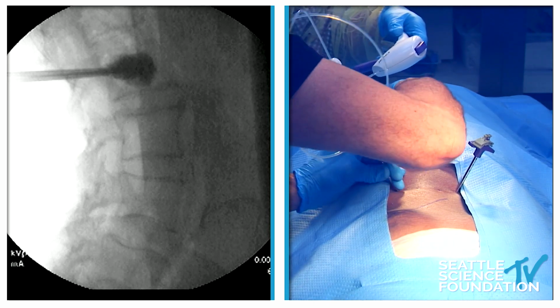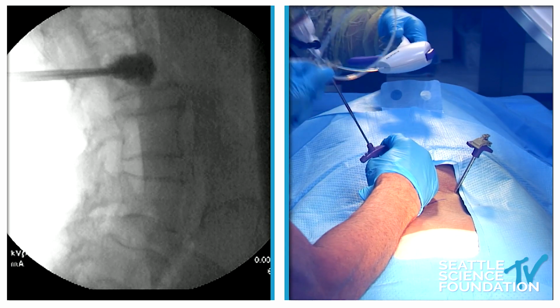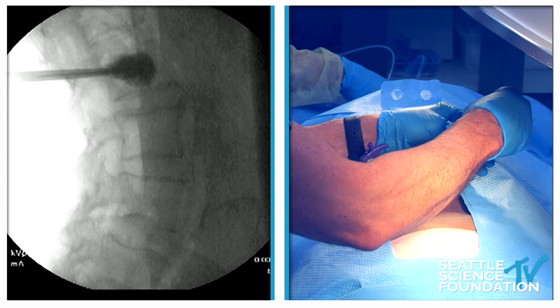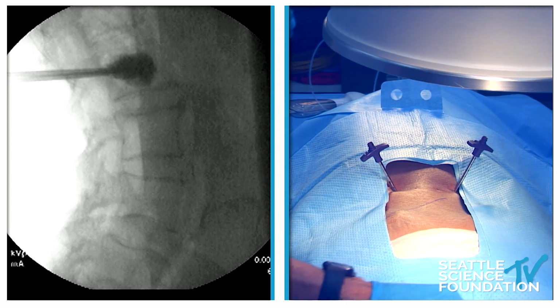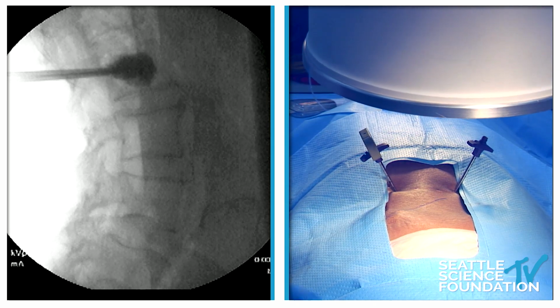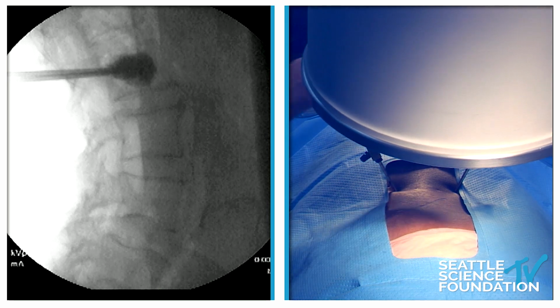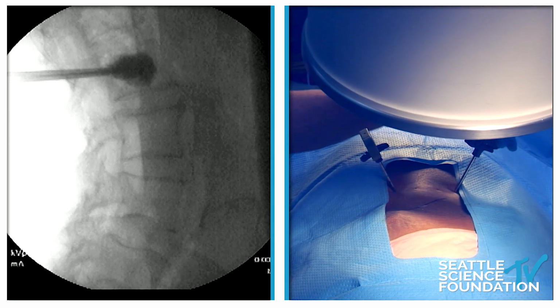One of the evolving features of cement augmentation is when the French originally came up with vertebroplasty, which is using a syringe to directly inject cement. It was very thin and very fluid-like and not very viscous.